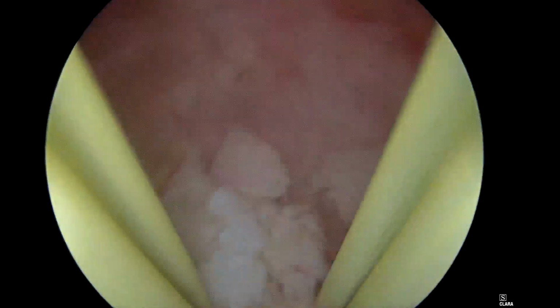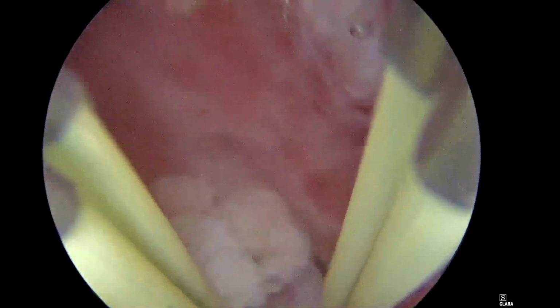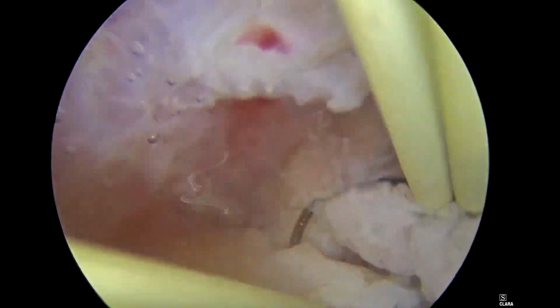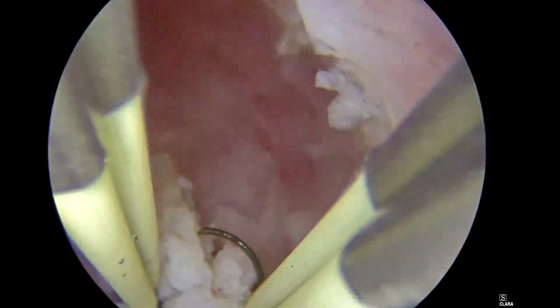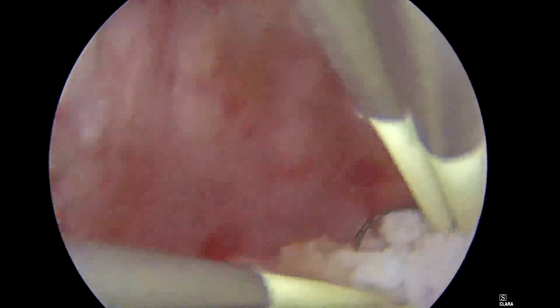Still, we have some open vascular channels and bleeding. This means again that the intrauterine pressure is lower than the pressure inside the open vessels. In my personal opinion, if you increase the fluid pressure, it will tamponade the vessel. Look at the bleeder here. Tamponading the vessels by high pressure might carry a little risk of fluid overload, but it outweighs the risk of fluid absorption, the possibility of air embolism, and compromising the field of view with a messy, bloody view. People get panicked thinking that this is dangerous.